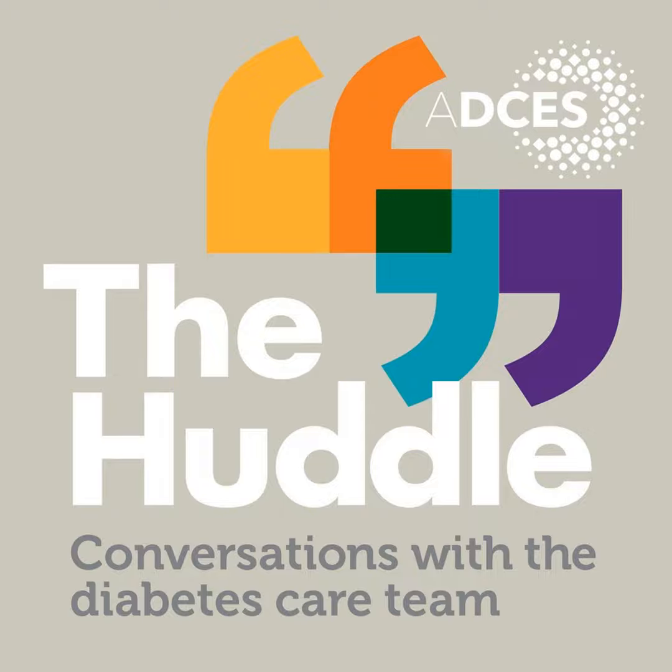For adhesives, there are actually a lot of options, and it's great to work with the diabetes educator to discuss them. I personally like SkinTac a lot, which I use underneath the devices. People can purchase it on Amazon pretty cheaply and have an ongoing supply. SimPatch is another one that you can put over it. There are a lot of similar types of products that can go on or over, and certain ones might work better for certain people.